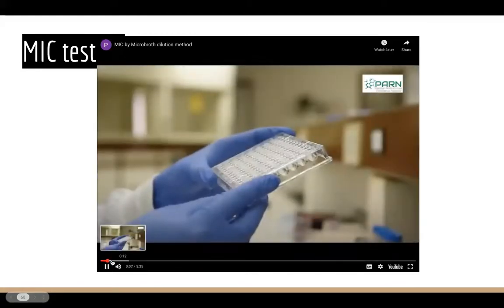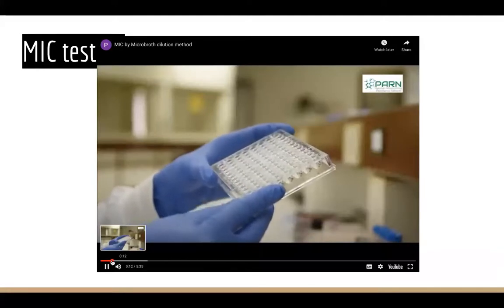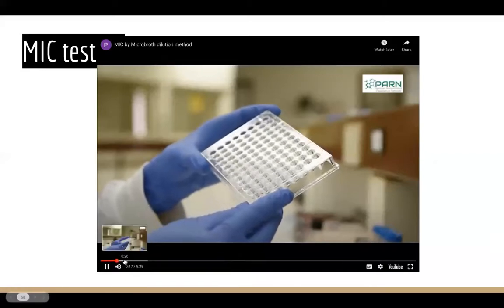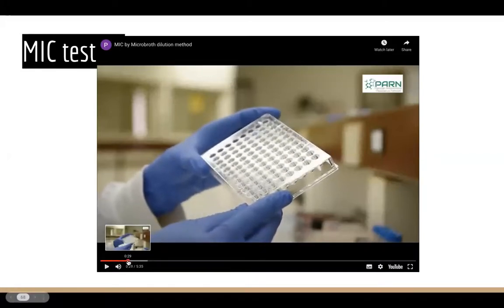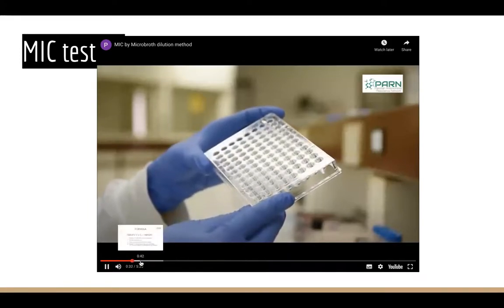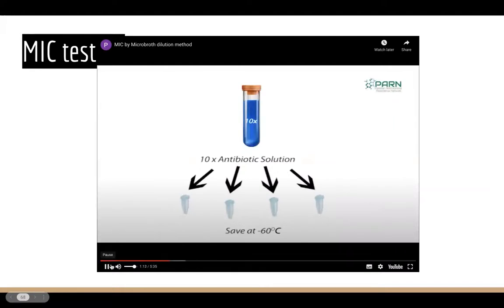MIC stands for minimum inhibitory concentration. MIC can be performed by different methods, including broth dilution, agar dilution, and E-test method. We have already discussed E-test method can easily be performed in a clinical laboratory. Antibiotic solution can be prepared. P stands for potency of antibiotic powder in microgram per milligram. The antibiotic solution should be prepared at a concentration 10 times the highest concentration to be tested.